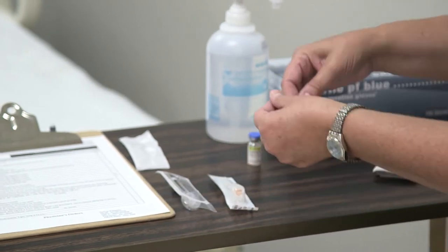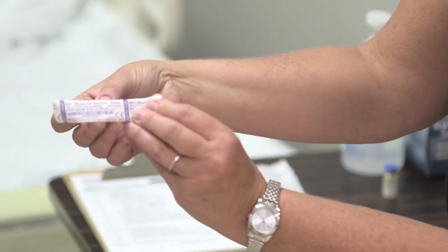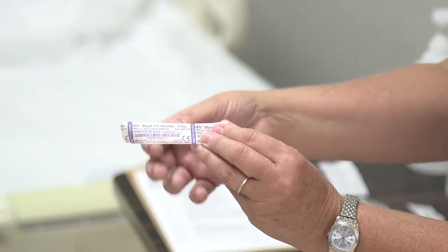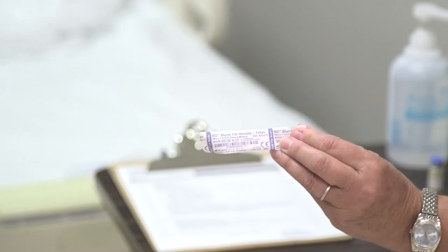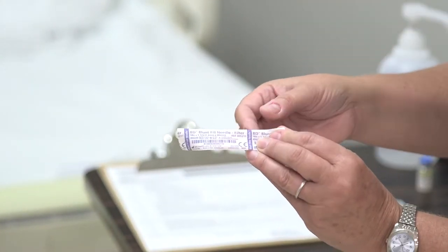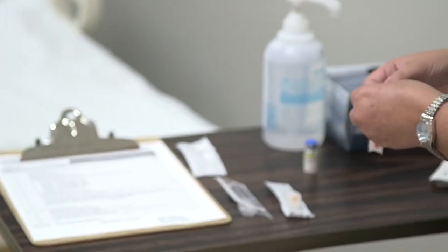And then first I'm going to use a blunt needle, which means there's not really a sharp on the end of this needle. It's going to help me withdraw the medication from the vial, and then I'm going to transfer it to the actual needle I'm going to use on the patient. That prevents the needle from dulling the one that I'm going to inject the patient with.